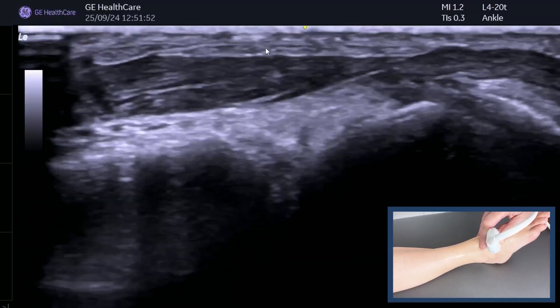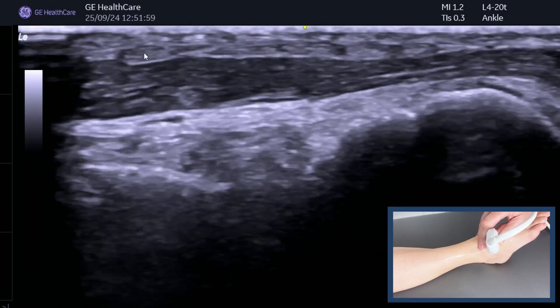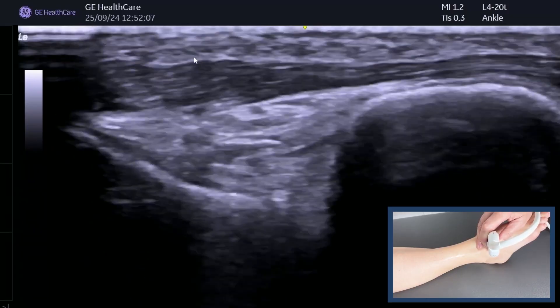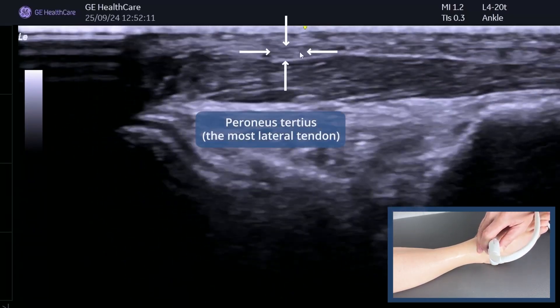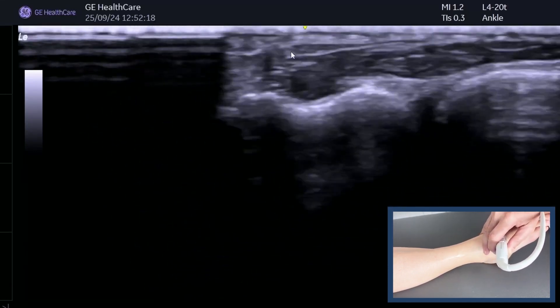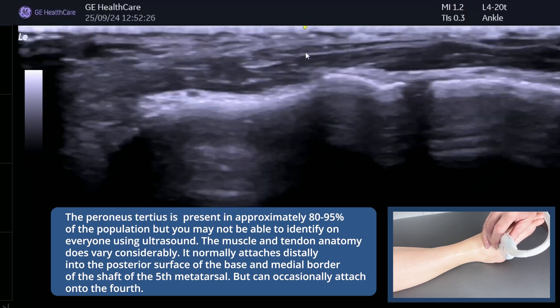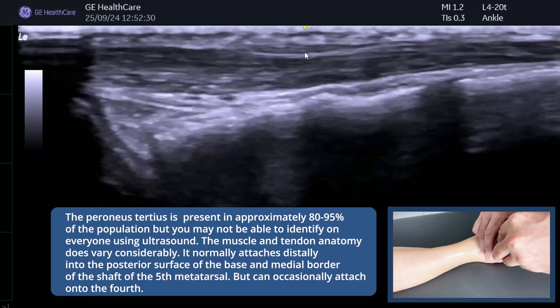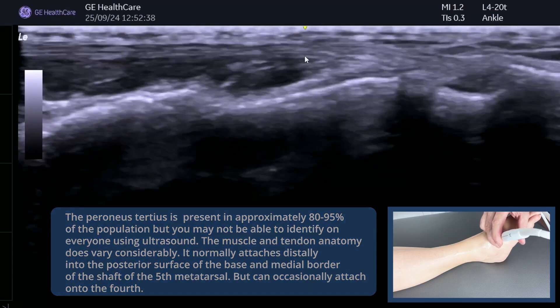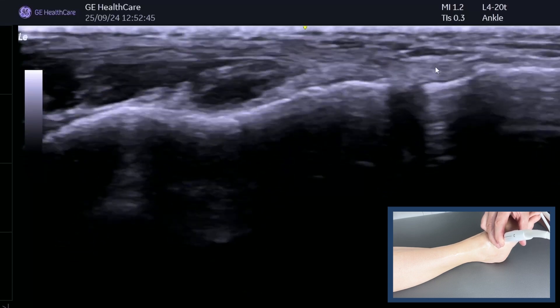Can we see four slips? Yes — one, two, three, four. Now this is an interesting case: a normal variant. If you notice you've got five extensor digitorum tendons, or one extra tendon a little bit more laterally, that's actually peroneus tertius. Normally this will go down onto the fifth metatarsal. Let's follow it down and there it is going on to the fifth — so yes, this is peroneus tertius. You can also go into long section and get a lovely image of peroneus tertius going into the fifth metatarsal.